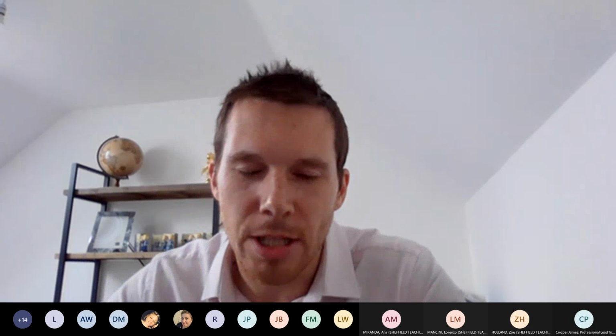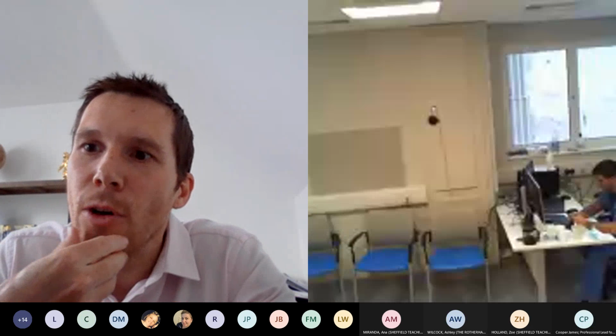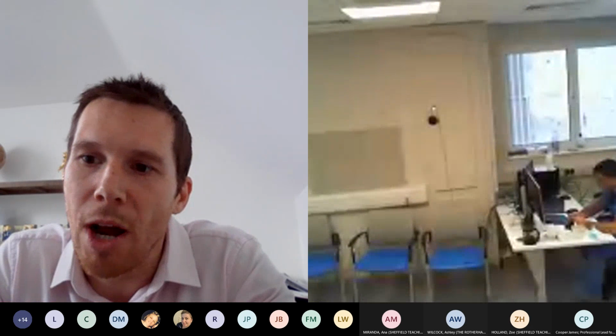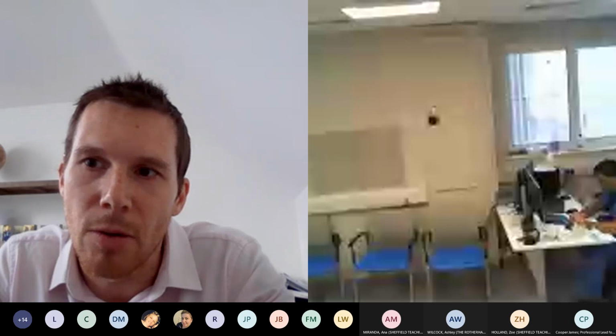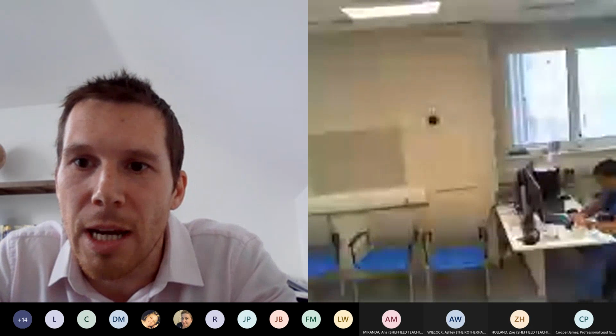So there's loads and loads of topics, and we're unfortunately not going to get a chance to go through them all. Do you want me to start with a bit of a recap of what I look for on the chest X-ray? That's where I'd normally start. We'll have 10 minutes on that. I'll then start talking about consolidation. What other things do you guys want to see?